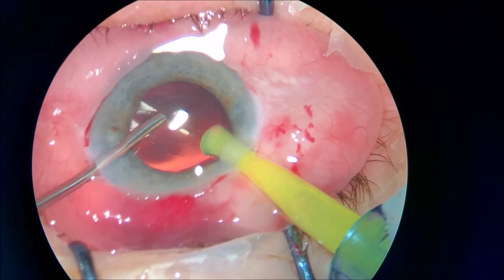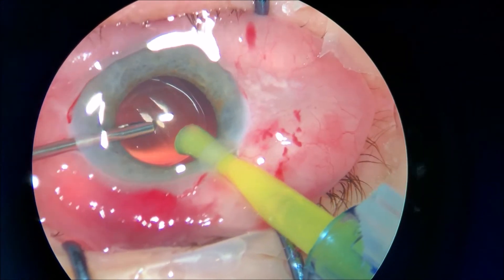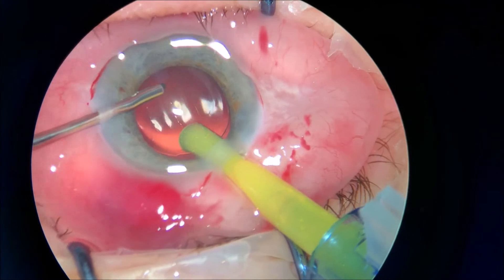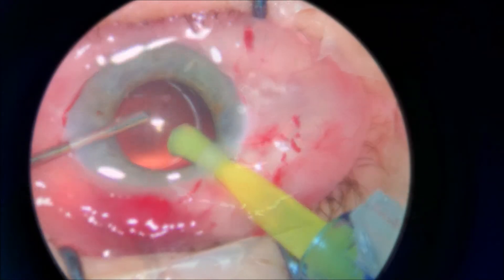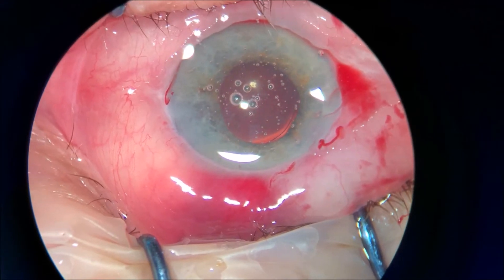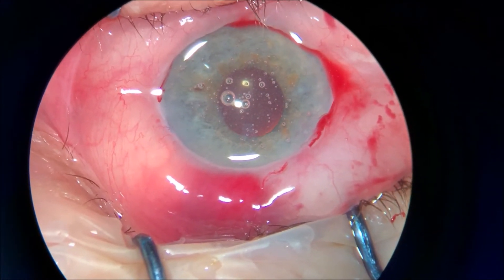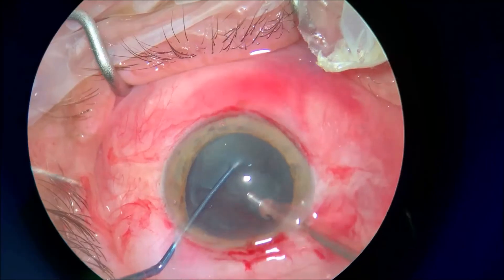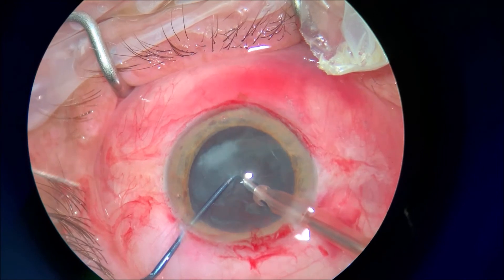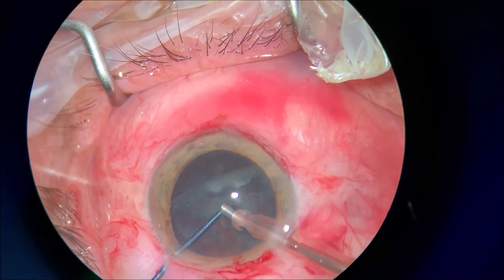And using at the end of the surgery pilocarpine, or any agent that can constrict the pupil, will reduce the complication of iris incarcerated into the ports to a minimum. So you have here the second case.